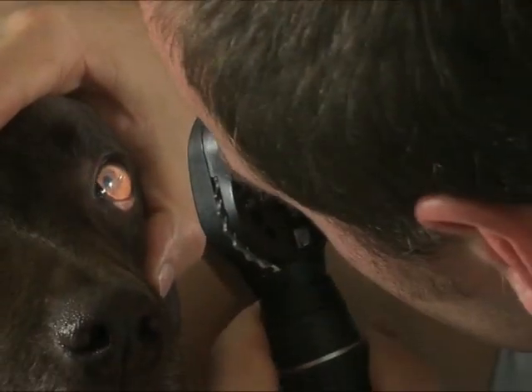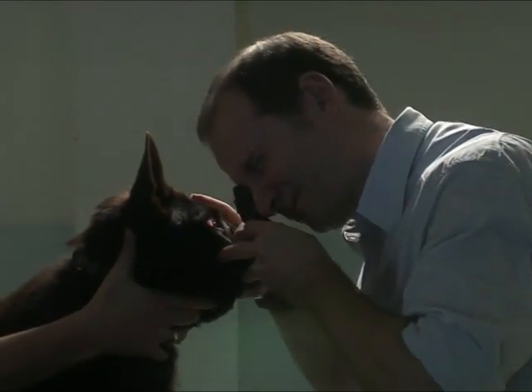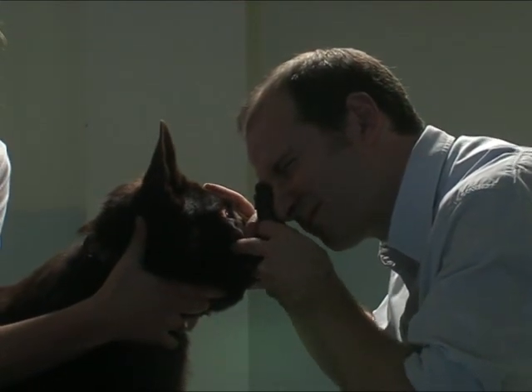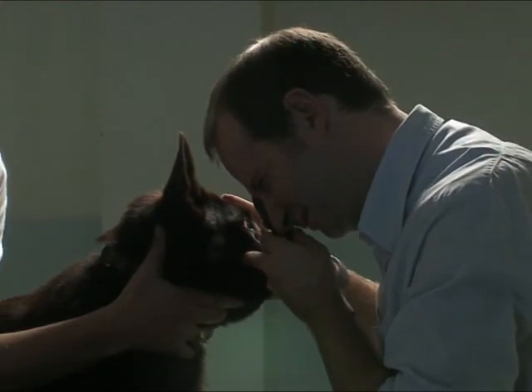Ideally, you should use your left eye to look at the dog's left eye and your right eye to look at the dog's right eye, on the basis that if the dog's nose and your face get in the way of each other, you won't get a complete exam. If you have a dominant eye, and most people do, for example, I can use both eyes, but prefer to use my left. I can use the left eye to look at the dog's right eye.